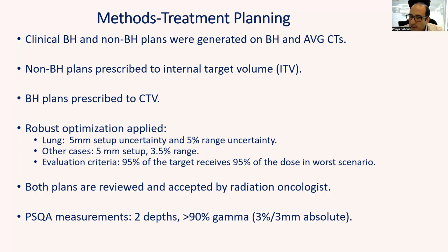Of course, both sets of plans, breath hold and non-breath hold, were reviewed by a radiation oncologist, and they were considered as clinical plans. And then we did IMPT QA for these using a 3% dose, 3 millimeter distance to agreement criteria, using a 90% absolute gamma pass rate.